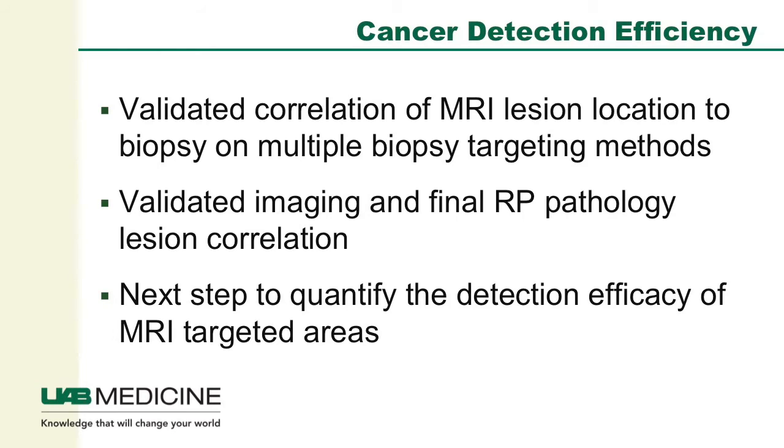We were able to validate that our ability to detect, fuse, and biopsy where we think we're biopsying based on the ability of our probes to track that location was validated in multiple different parameters. So this then led us to bring this commercially to the market, where the Philips Corporation did, rather, so that we can get this technology out available to patients in a broad spectrum of locations, not just at research institutions or select academic institutions throughout the country.